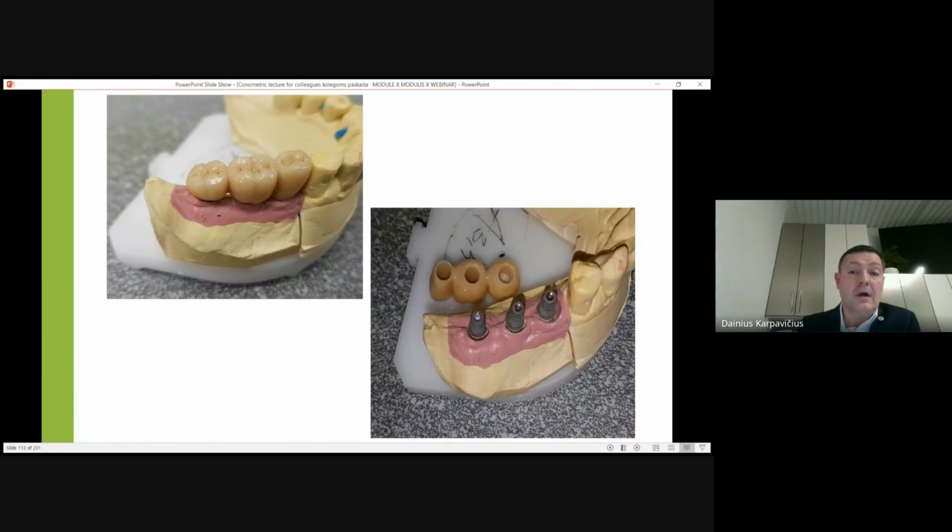Take a look at our also old cases. We have no holes here because, as I said previously, I like to use even a crown remover, not to use a screwdriver. Sometimes I remove with the crown remover for me because it was easy for me to understand what possibilities do we have. So you see the bridge, you see that our bridge is free of conometric crowns.